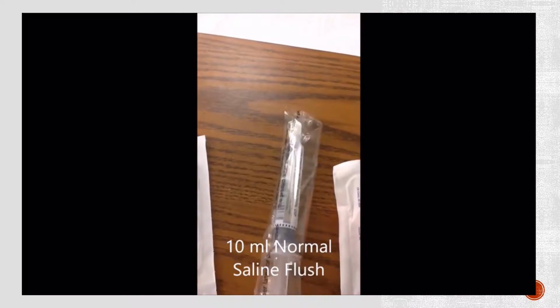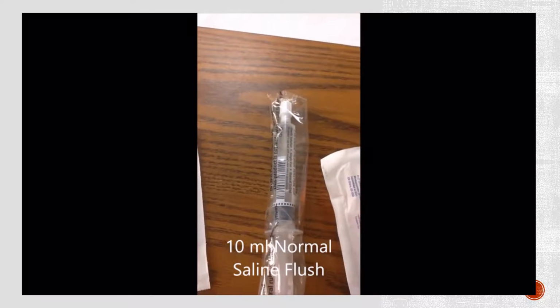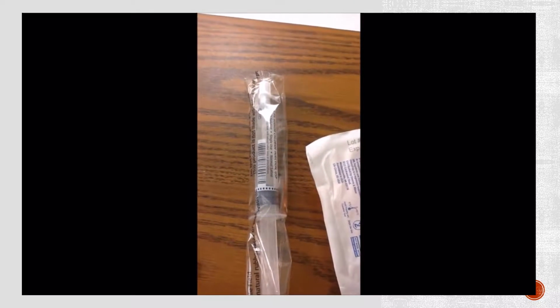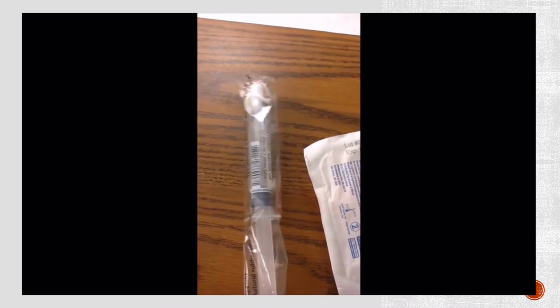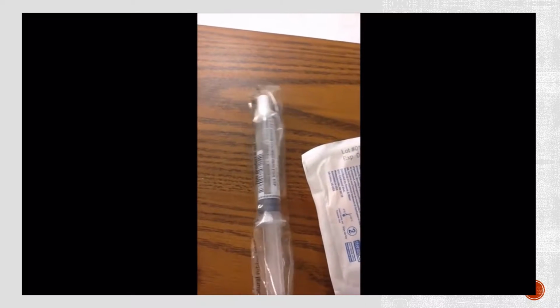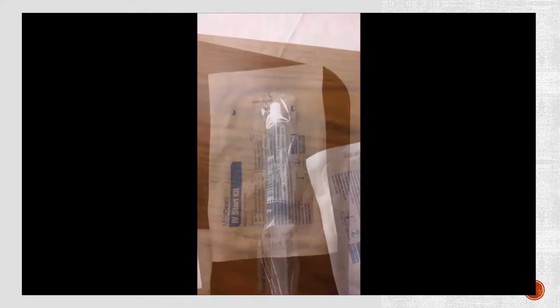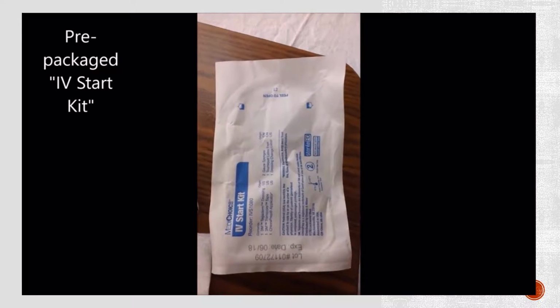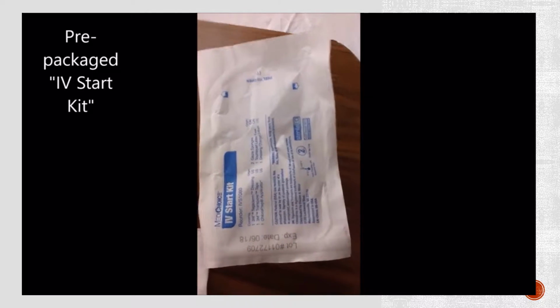Now this is what you would use to prime your tubing with, and to check that the IV is in the vein by withdrawing blood, and then you would flush, making sure that it flushes without a problem. An IV start kit is very important to have, and this has some of your essentials that you will use when you go to start an IV.